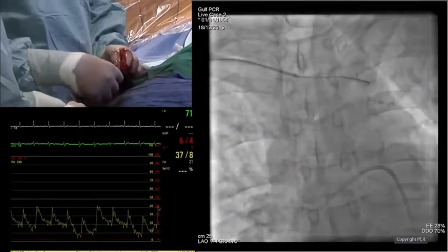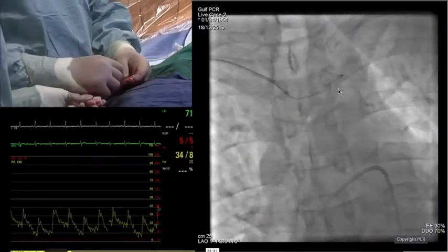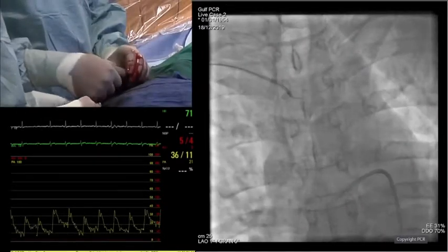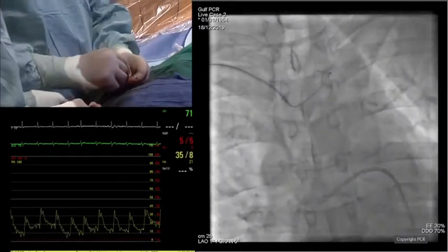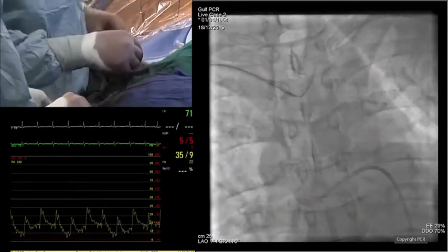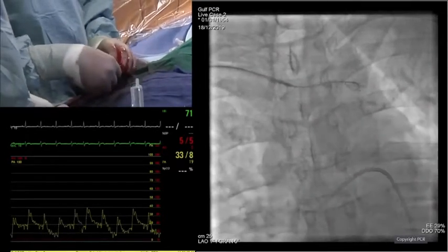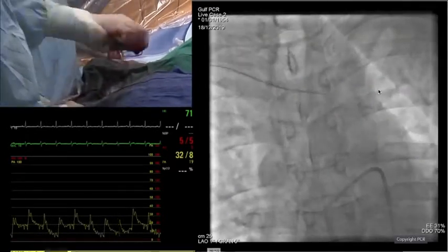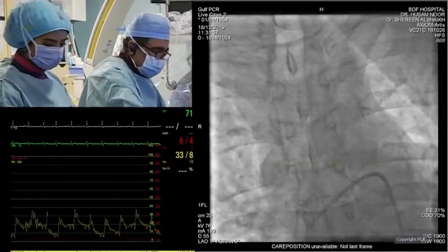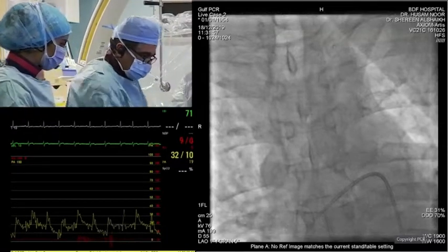Okay. So we'll leave you to do that, since I was suggesting to forget about the sheathless guide and use your regular guide to get the case going. Yeah, I just did that. We had difficulty doing that earlier as well, unfortunately. But anyway, that's live. You can go femoral or the left radial. You can have your time. Well, we're not going to put any pressure on you, Hussam. Just give me 2 minutes. I know you're skilled enough to get out of this problem.